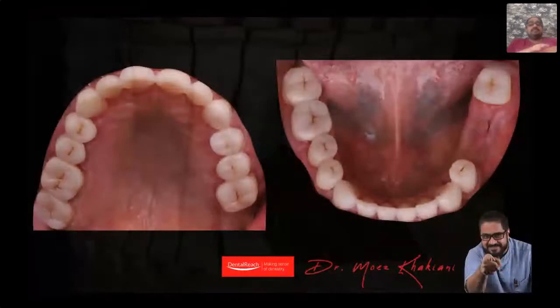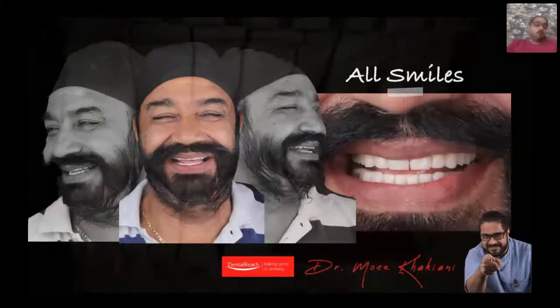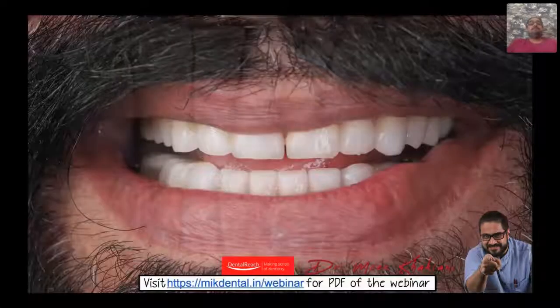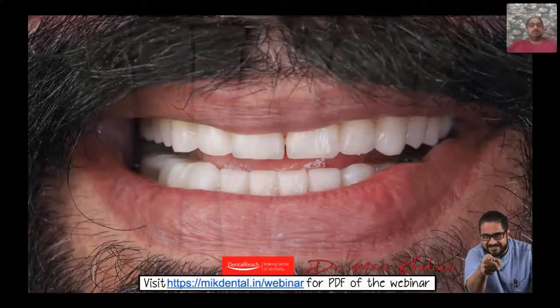Look here, this is purely occlusal dentistry. Function with aesthetics. Aesthetics has not been compromised. Recognize the fact that this looks like a very happy patient. He is smiling a lot more than what he was smiling before. And yet, recognize the fact that underlying tooth structure is not seen at all.